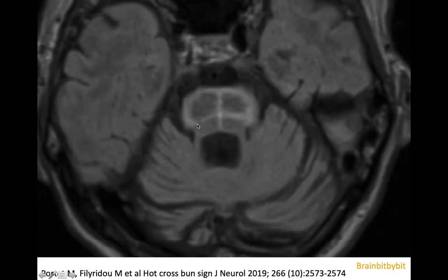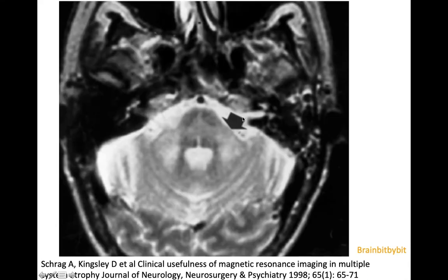The hyperintense fibers in the pons are the transverse pontine fibers and the fibers going from anterior to posterior, giving it the appearance of a hot cross bun. That is easy to see. Sometimes there's also hyperintensity of the middle cerebellar peduncle, but unfortunately this is not the case in the majority of patients.